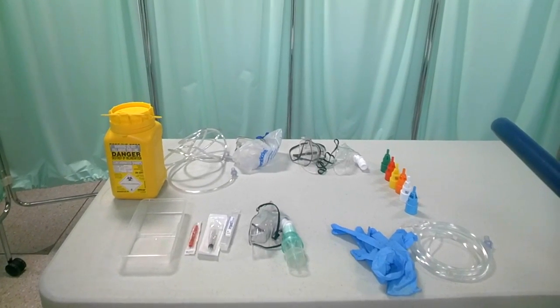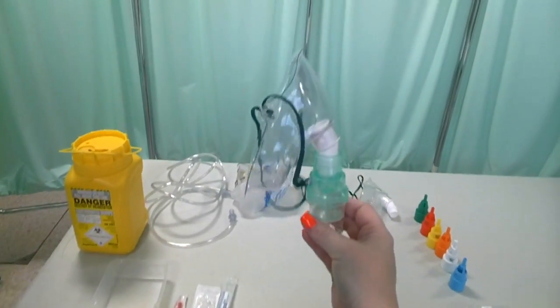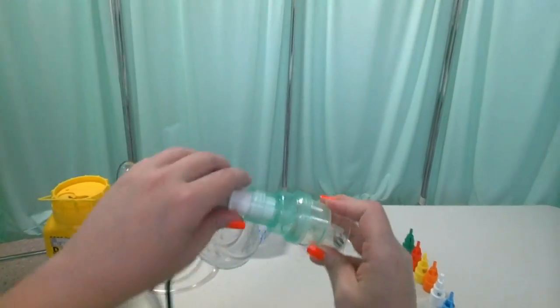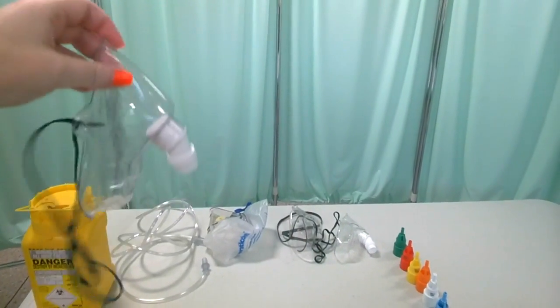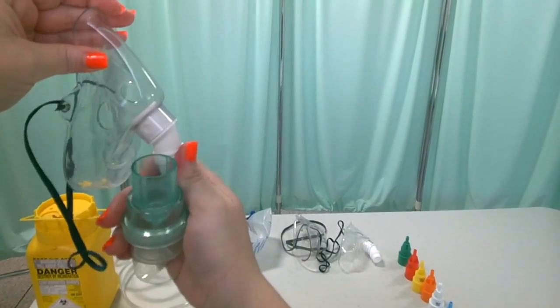Alright, so in front of us we've got our oxygen delivery equipment again, and this time we're going to discuss in a little more detail this device here, which is a nebulizer mask. Now I just want to explain to you the different components of it. So you've got the mask itself, which does look on the surface quite similar to a simple face mask, but this attachment is completely different, so don't get the two confused.